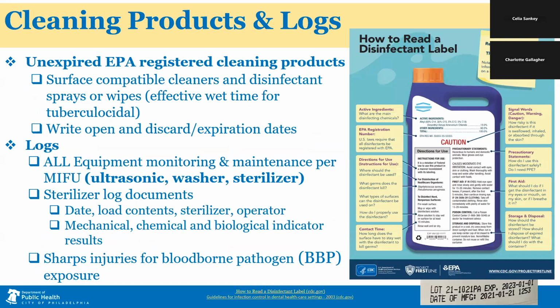Unexpired cleaning products should also be handy and dated at opening. Please be sure to check manufacturer's instructions for the duration of effectiveness once the product is opened, and mark that date on the container as well, because in this case, the discard date becomes the new expiration date. Be sure to have a sterilizer and needle stick log in the area as well.